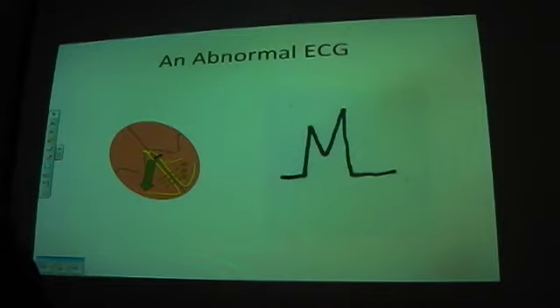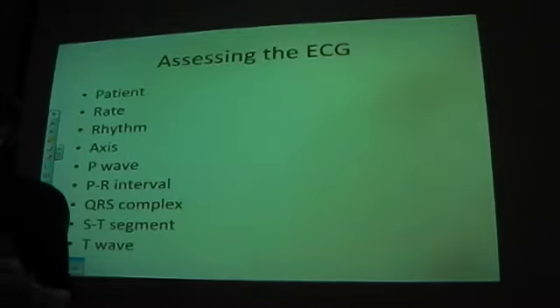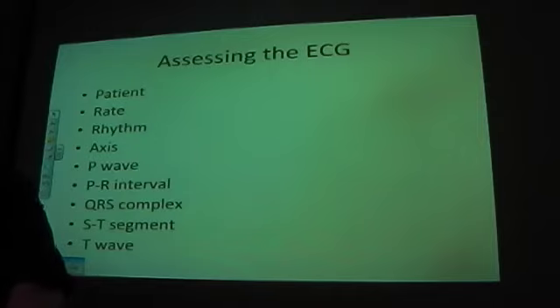With that, you can actually work out the abnormal aspect of most ECGs if you base it on how the investigation's actually conducted.